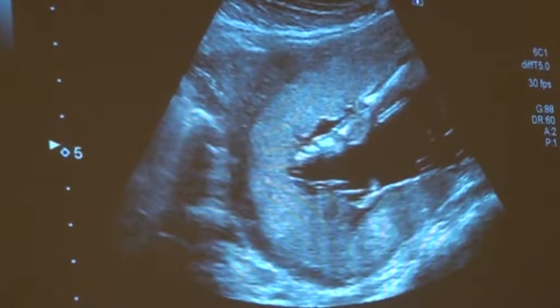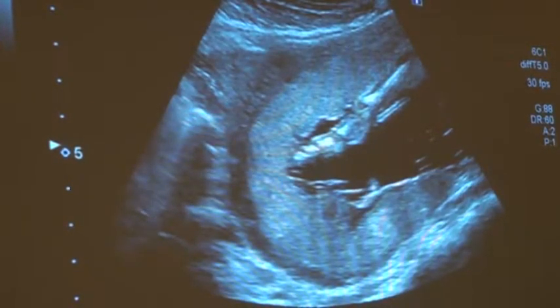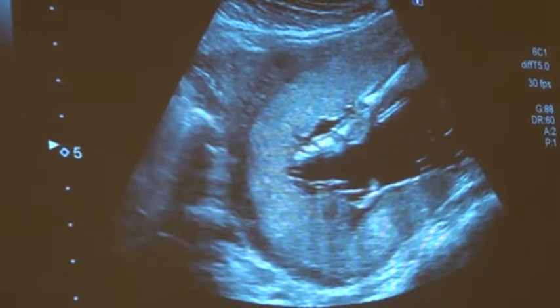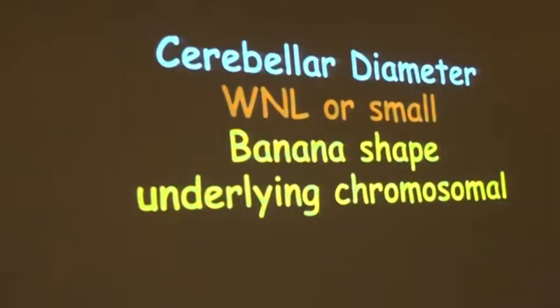If it is thinner, are we dealing with accreta, increta, percreta? If it is thin, are we dealing with segmental contraction? If we don't see it at all, what's going wrong with that? We can make the diagnosis on this basis that this is intrauterine pregnancy. You measure the uterine wall all the time.